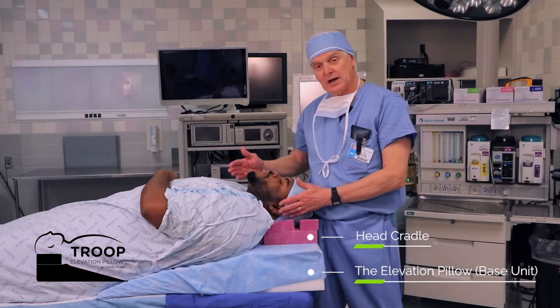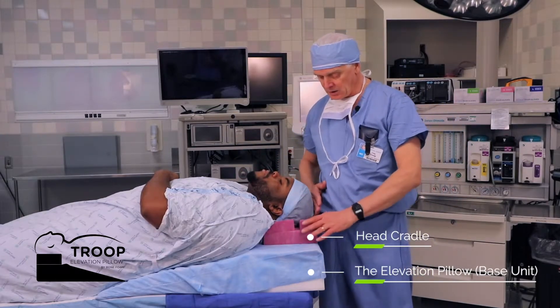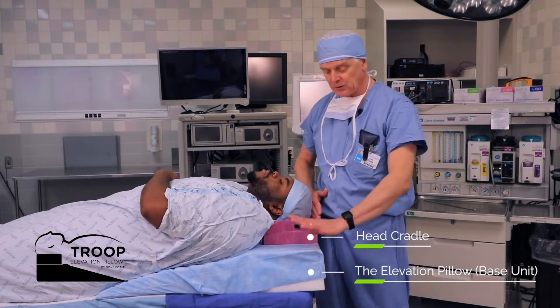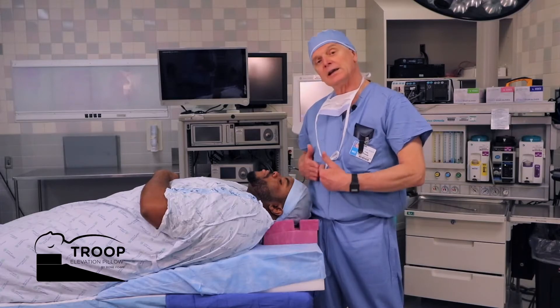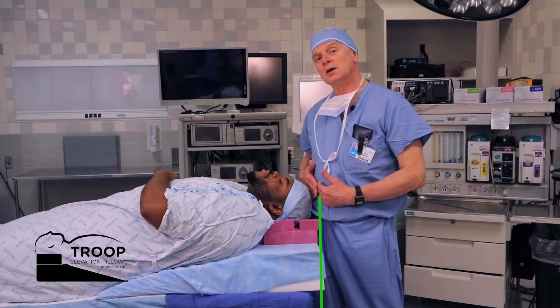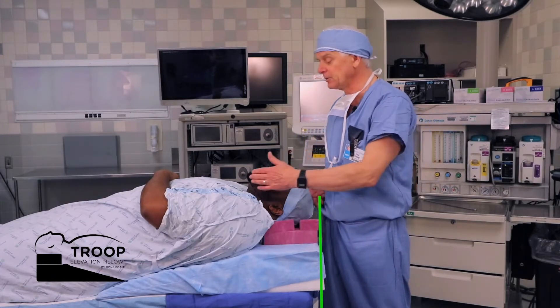Notice that the patient's head — Quinton's, our model patient here today — Quinton's head on the standard intubating pillow, on the Elevation Pillow, is sort of in line right at the edge of the OR table. In other words, his head and neck is right close to you, near your chest or abdomen.